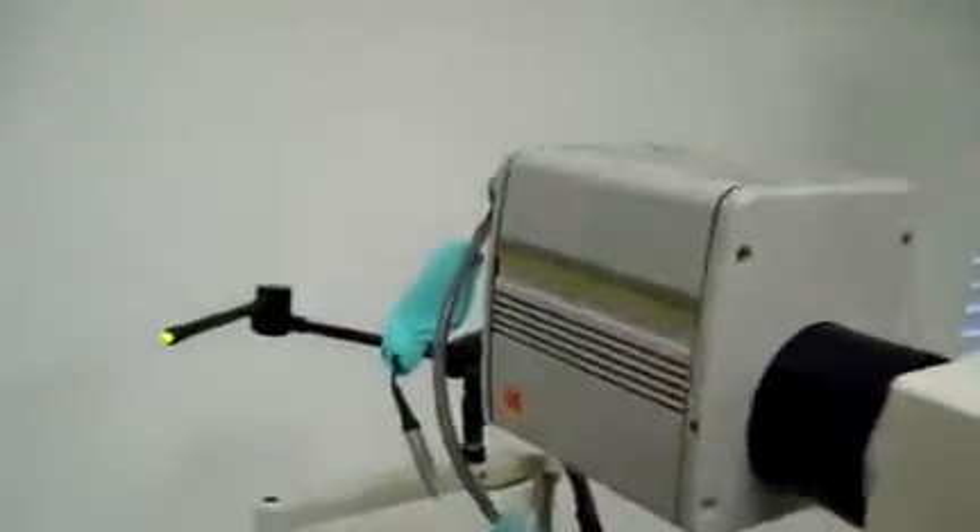Hey, it's Keith with DCSP Medical. We're looking at a Topcon TRC50IA Retinal camera with the Kodak Mega Plus camera system on it. It's got the Topcon adapter.